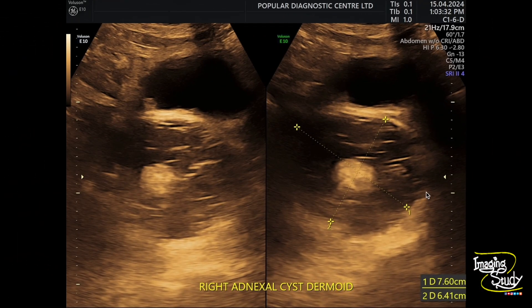Here is the measurement — you can see it is around 7.6 by 6.4 cm. If you categorize it in IOTA, then it will be an IOTA O-RADS 2 lesion. We have also used color Doppler, though the pictures are not available here, and there was no internal or any abnormal peripheral vascularity, indicating a color score of 1.